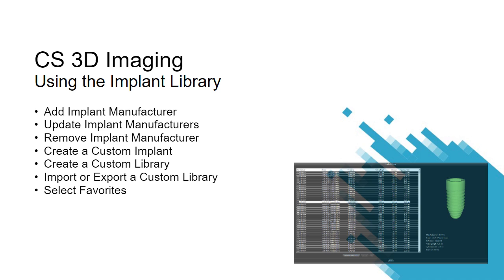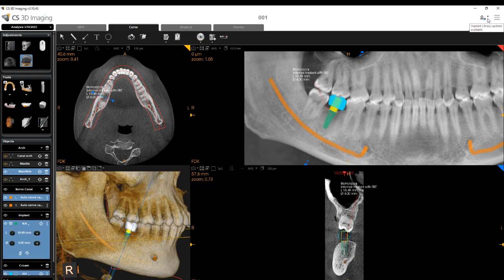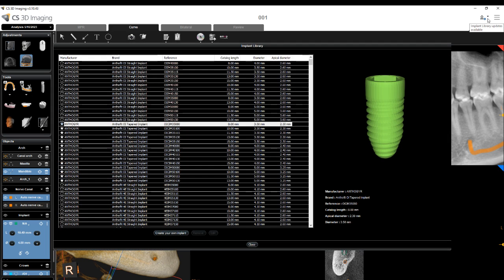By the end of this class, you should be able to: add an implant manufacturer, update implant manufacturers, remove an implant manufacturer, create a custom implant, create a custom library, import or export a custom library, and select favorites. CS3D Imaging provides a library of virtual implants for use on the Curve Slicing tab. You can add and remove manufacturers and import and export custom implant libraries.